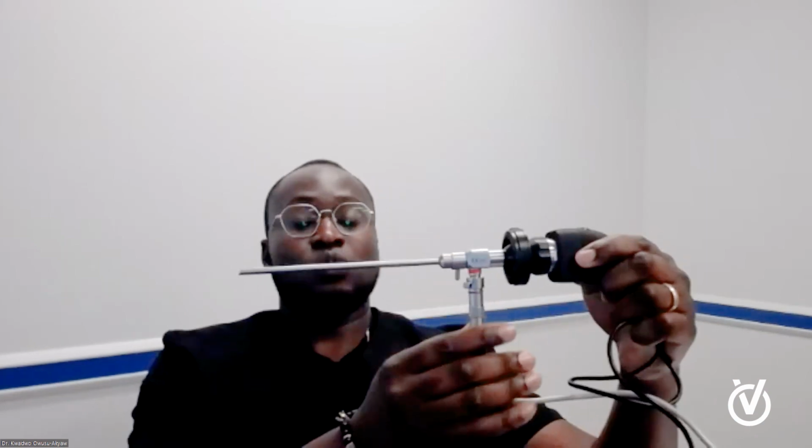So arthroscopy is using basically a small camera to look inside of a joint and to do work within it. So that allows us to do minimally invasive surgery. So I actually have a sample of an arthroscope here for you all to see. So this is what the camera looks like when we do an arthroscopic surgery, a scope, we call it, okay? And so it has a few different parts. So this part back here is the actual camera. And when we're doing surgery, we're actually using this to watch a screen and perform the surgery. It's like a video game almost, okay?